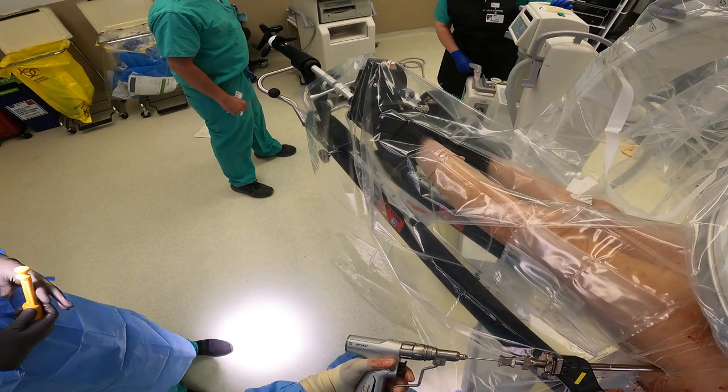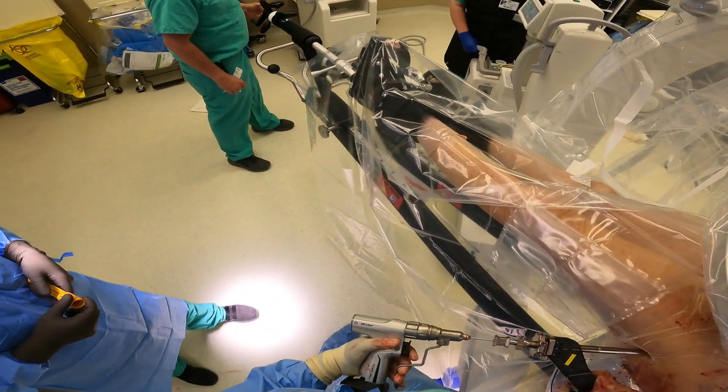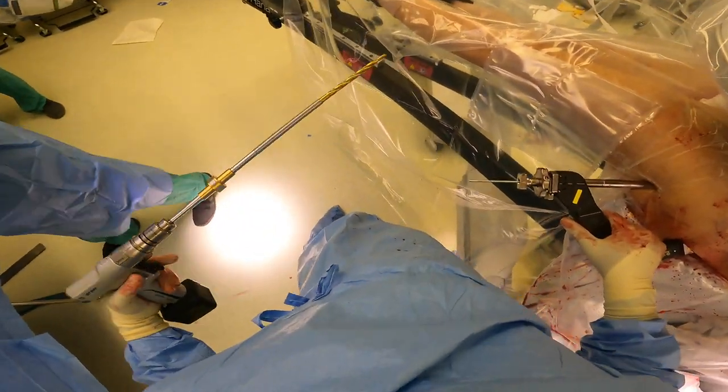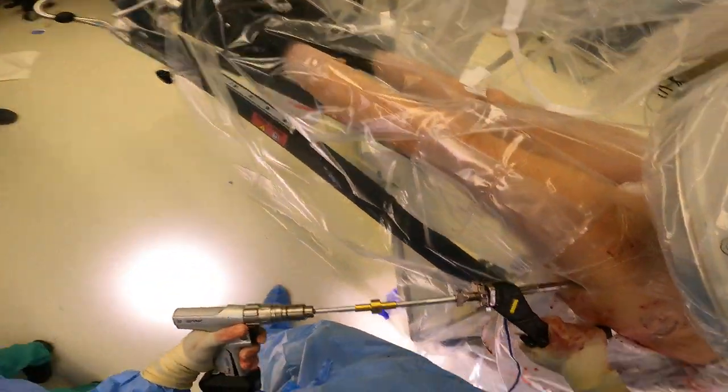This is a little device that stabilizes this area while we're drilling. This is a pin, and I need to make sure that this pin is in a good position within the femoral head. We'll check an AP view — which is an anterior-posterior view — as well as a lateral view to make sure that it's in a good position.